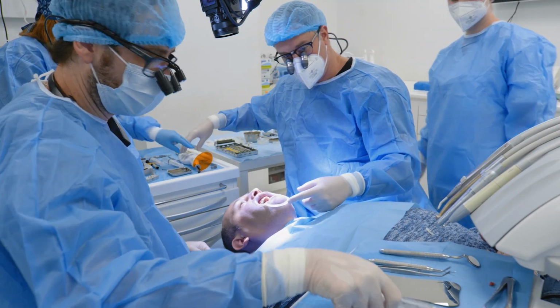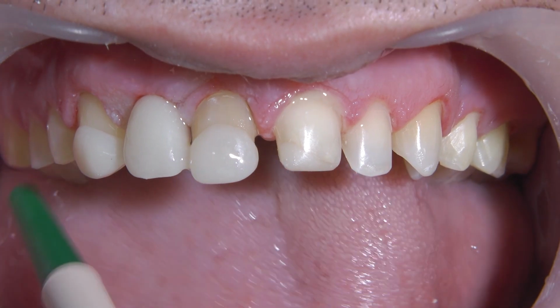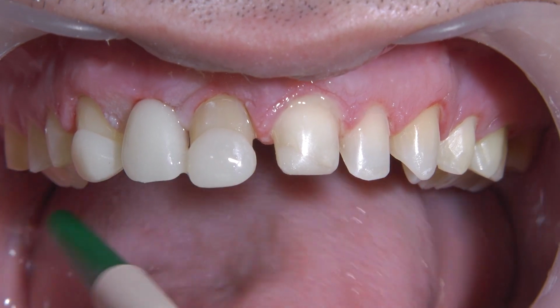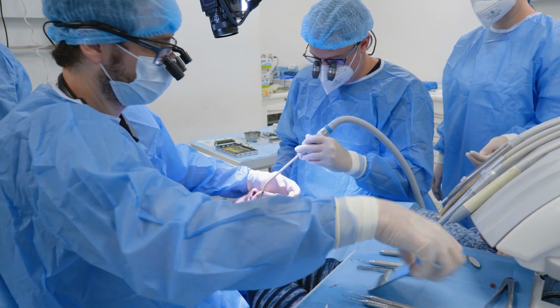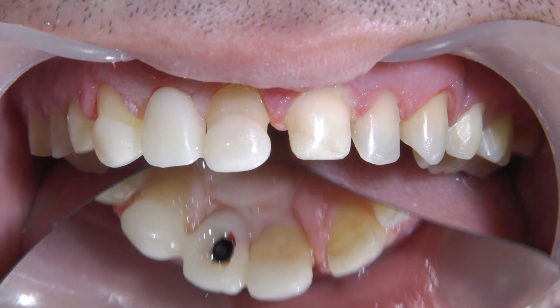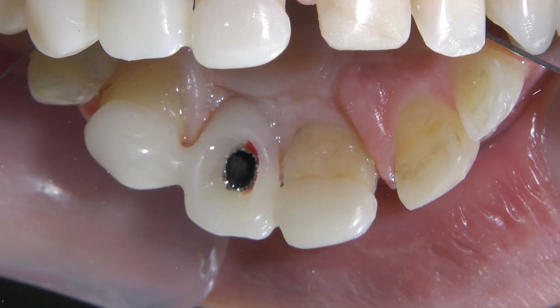Okay, the cylinder is captured. Look at the nice format of the lateral, very well positioned. You see here that I put all the way with the flowable composite. So let's unscrew.